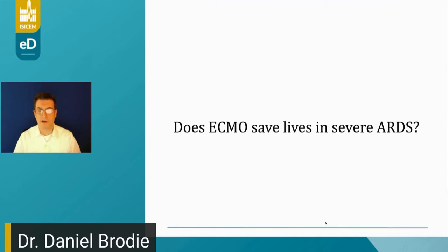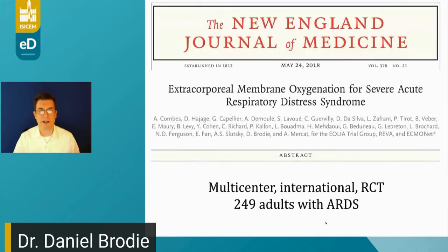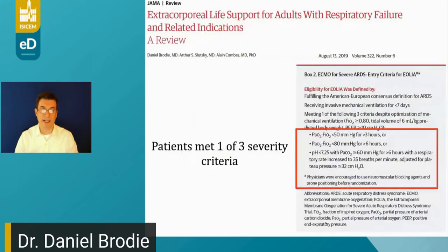But to really answer the question of whether or not ECMO saves lives in severe ARDS, we turn to the EOLIA trial. This is the work of Alain Combes and colleagues. This is a REVA network and an ECMONet study. And this was a multi-center international randomized controlled trial of 249 adults with ARDS. And I show you the entry criteria here because if we, in the end, believe that there's a positive signal, then these become the accepted indications for using ECMO for ARDS.